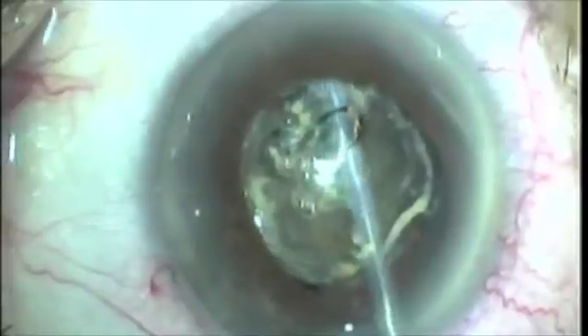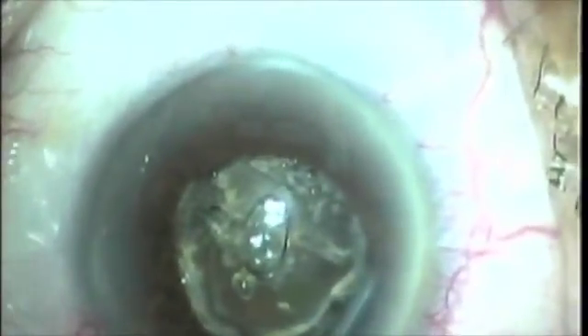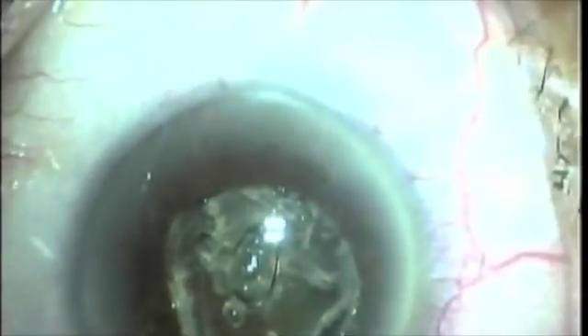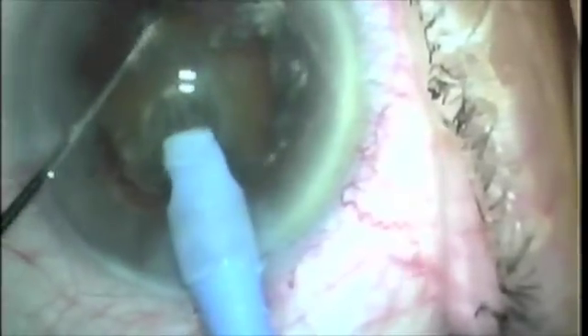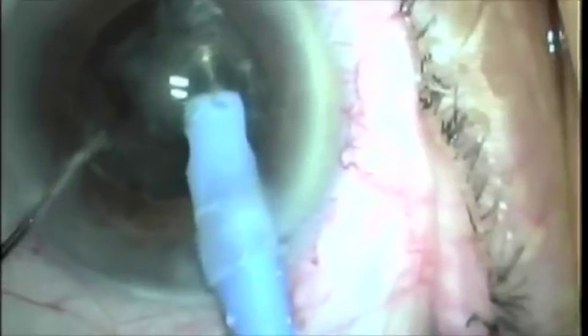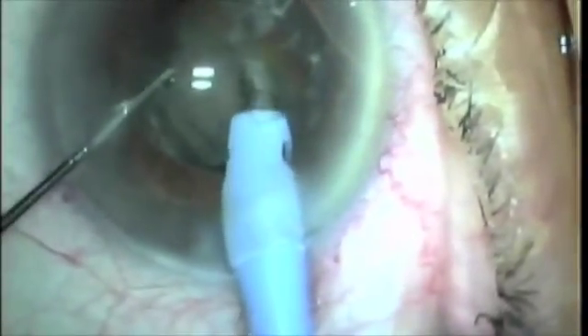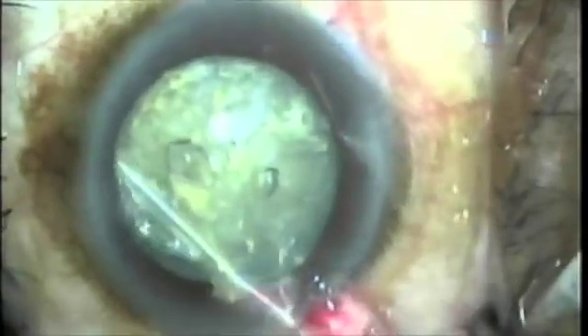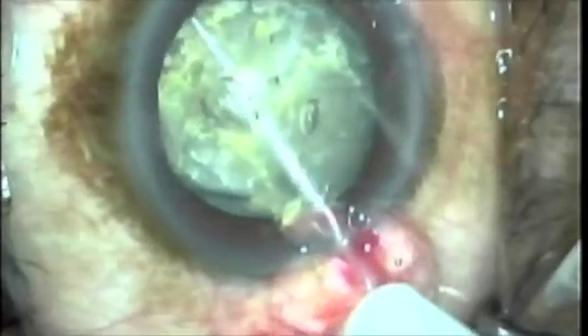Here we have a floppy iris syndrome patient. You don't have to use retraction pupil devices or anything like that. You just put a little visco under the iris and make a large capsulotomy. Then I put visco behind the nucleus and crack it — it makes that procedure pretty straightforward and pretty friendly to do.